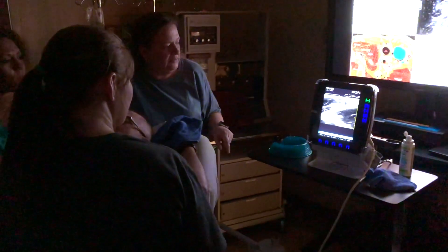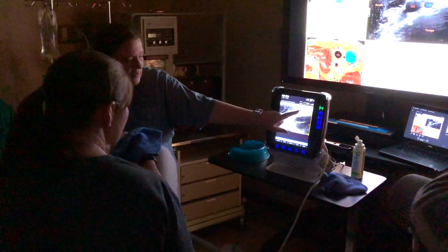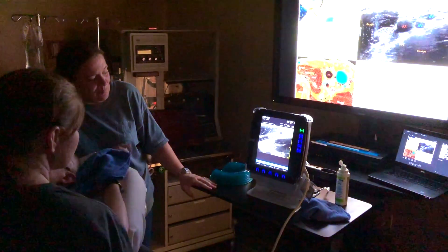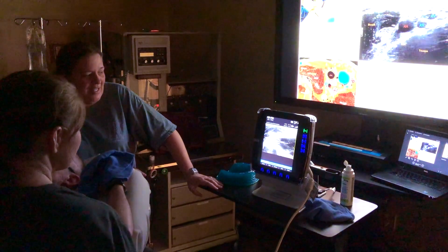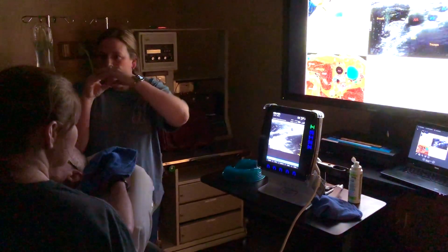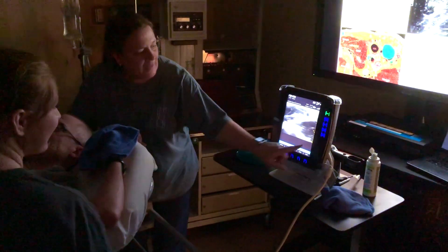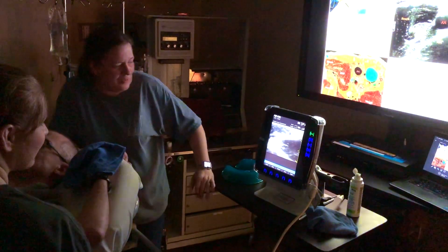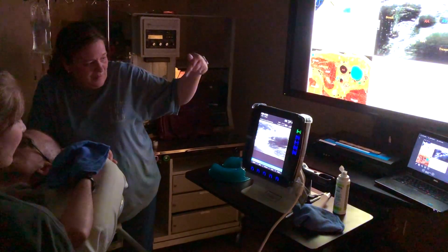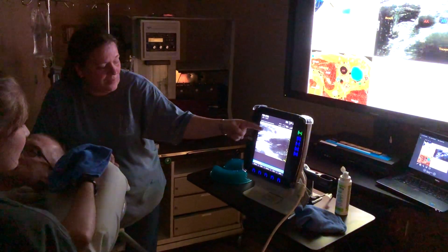The next place we went was another room with an ultrasound and pictures of common block anatomy on the screen. One of our professors would go over the ultrasound on one of us — we'd lay down and she would scan the area where the block is supposed to be done, talking us through different techniques and ways to find the best ultrasound-guided view for each block. Here we're doing the brachial plexus — the interscalene view, then the supraclavicular and infraclavicular view, and also the axillary view.